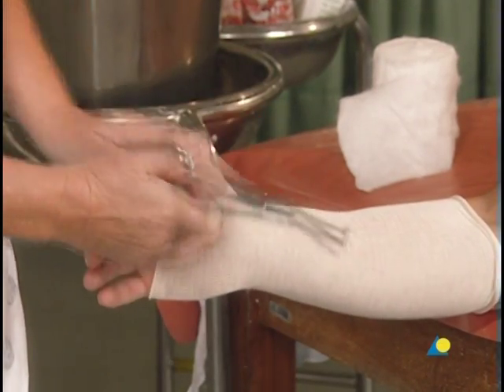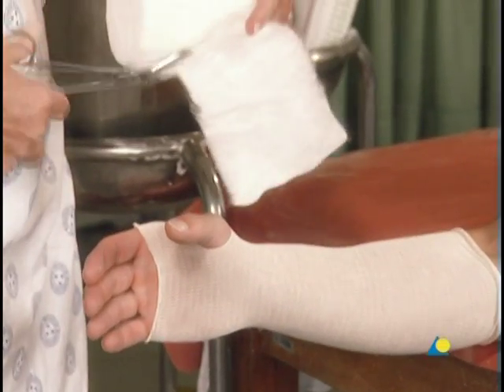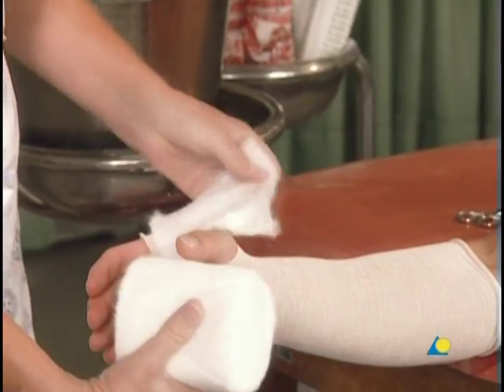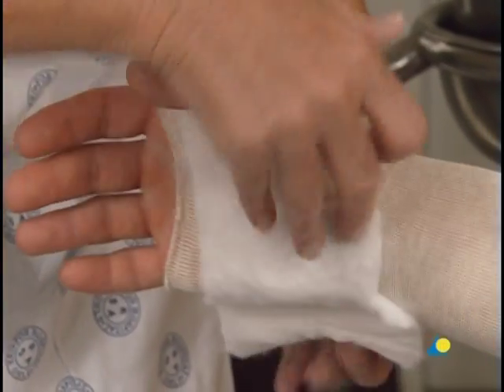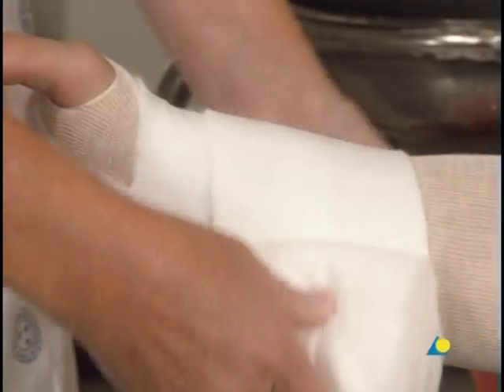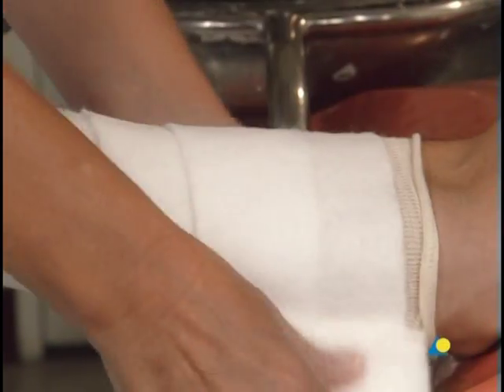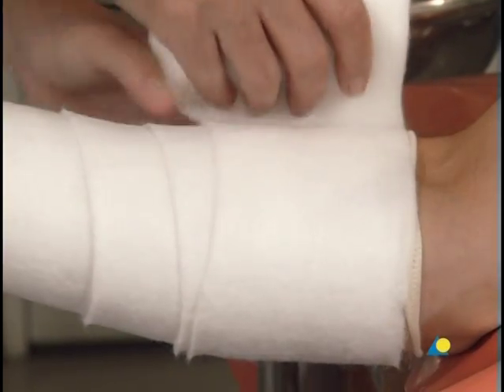The cotton wool is used for undercast padding, with a slit cut for the first web space. It is gently wound around the forearm with a 50% overlap to create a double layer of padding. The cotton wool extends beyond the planned edge of the cast so that, when the end of the stockinette is folded down, the cast will be padded.